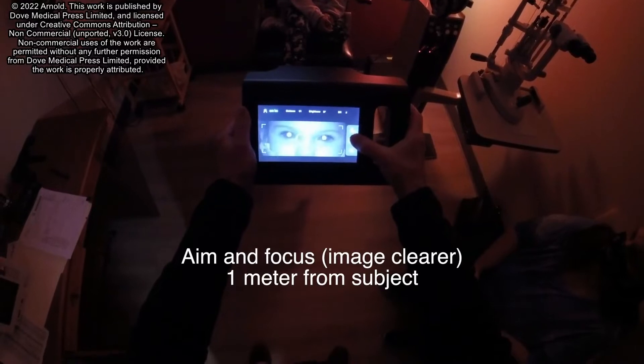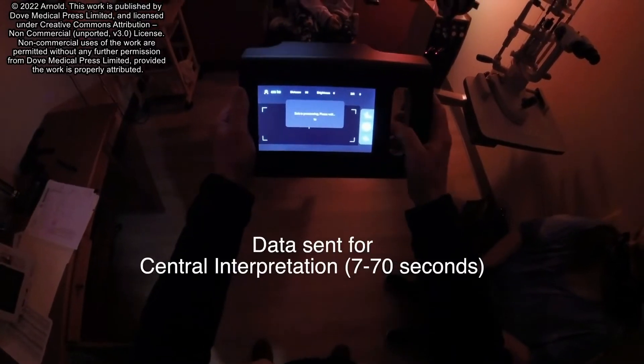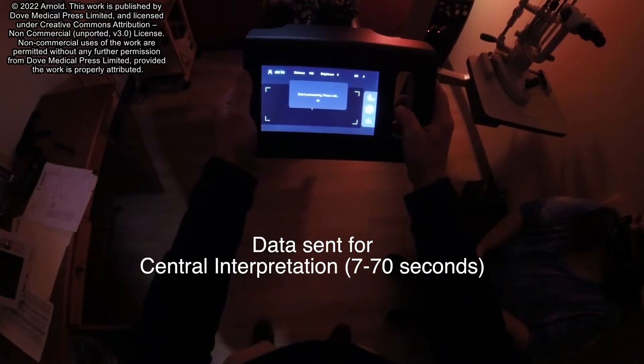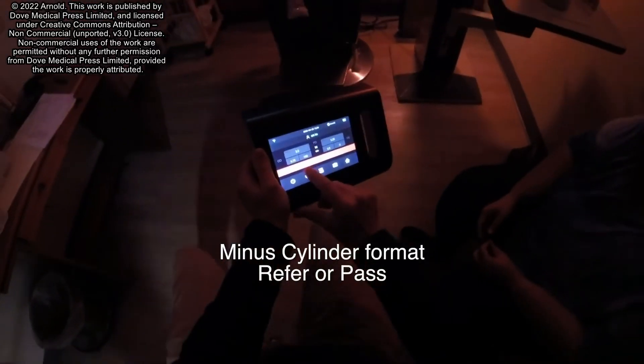See if you can see the pretty thing on the front. How does it look? Pretty good? Now it's processing — please wait. It's thinking. It says refer. It thinks she's also got a little bit of astigmatism.